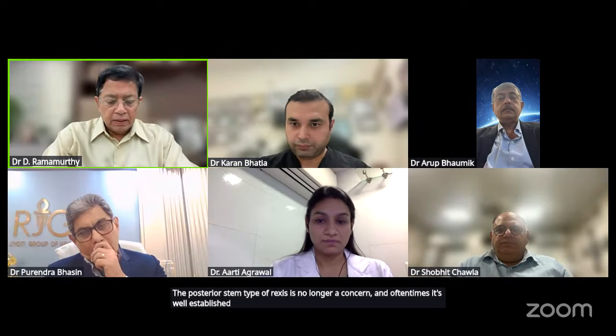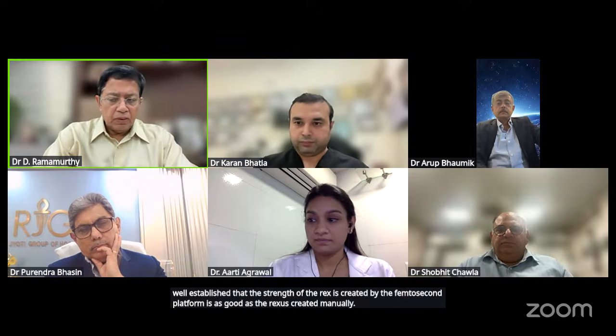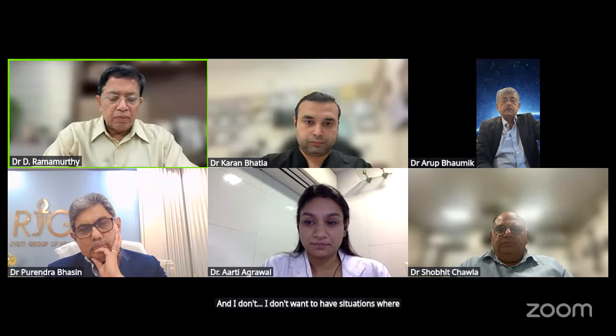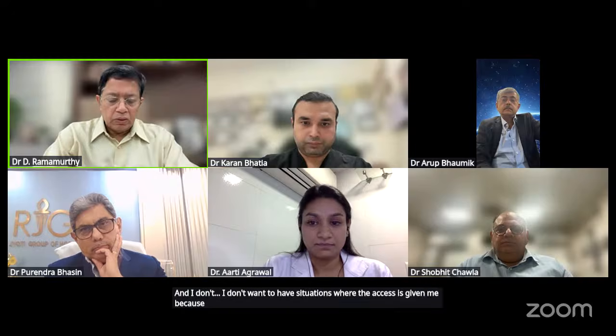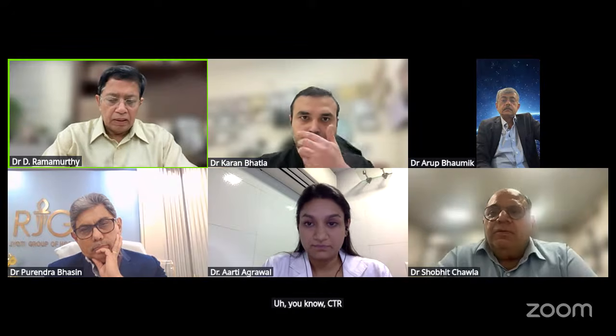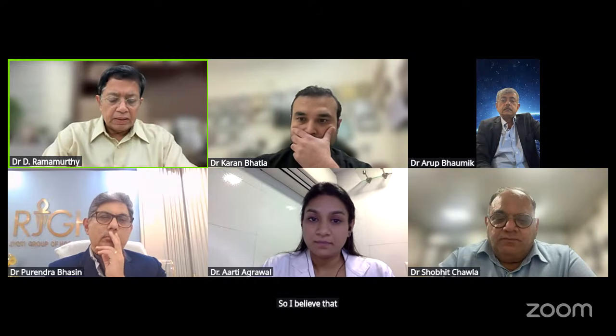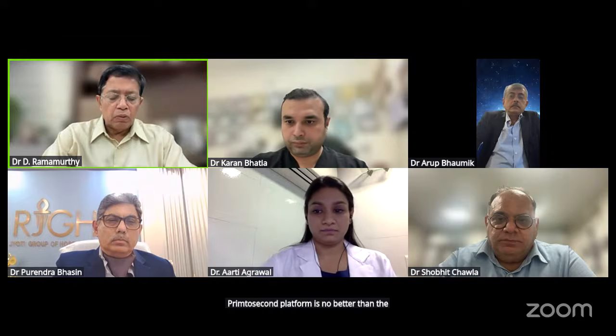It is well established that the strength of the Rexis created by the femtosecond platform is as good as the Rexis created manually. I have not had situations where the Rexis gave way because of endocapsular rings or CTRs or CTS or even the implantation of the intraocular lens. So I believe that the strength of the Rexis created by the femtosecond platform is no better than the manual Rexis, but no worse also.